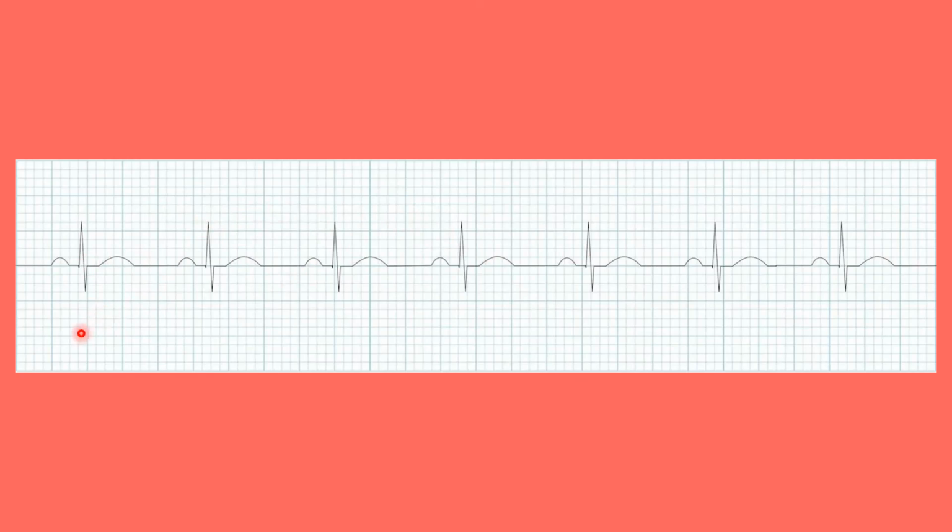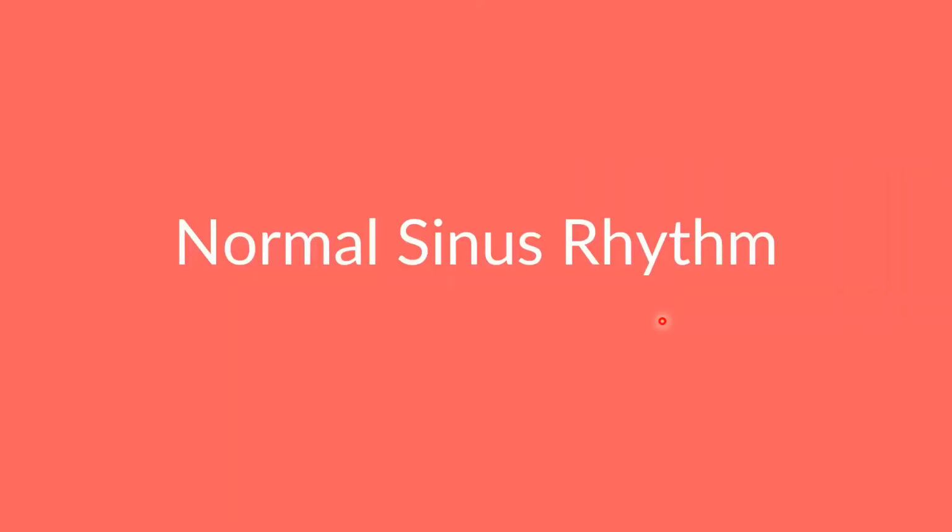This is regular. And then is there 1 P wave for every 1 QRS? Yes. Okay. And I can't stress that enough. This one's super clear, but I still to this day will go P QRST, P QRST, P QRST. Because if one of them is missing a P wave, it's a totally different rhythm, or at least there's something else you need to add to that explanation. So that is super important.